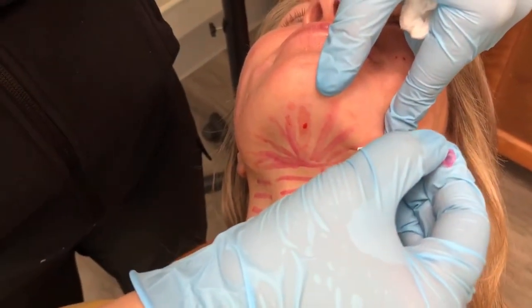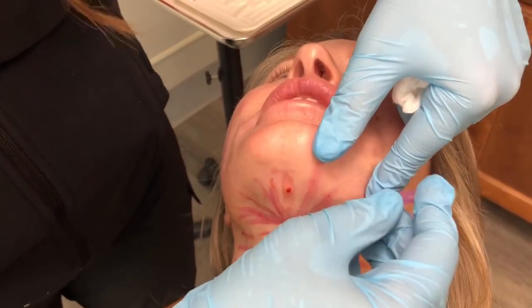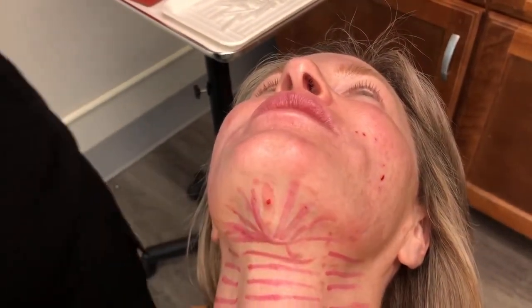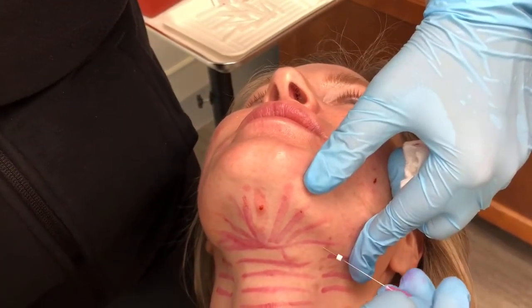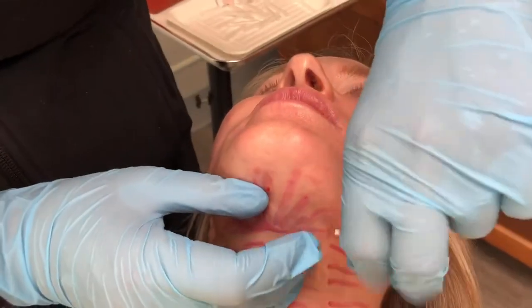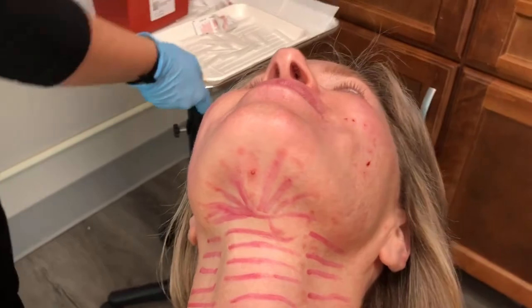This has significant advantages over using only Kybella. I can use this even when the patient has more of a turkey neck, because that loose skin will get tightened — maybe not totally, but as much as the natural collagen and elastin is able to do. We've put in about 10 to 12 threads fairly quickly. This is not a long procedure. It's time for you to start doing this for your patients and adding this to your patient services.